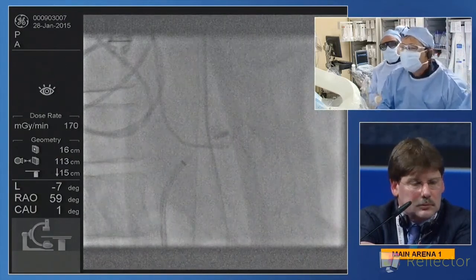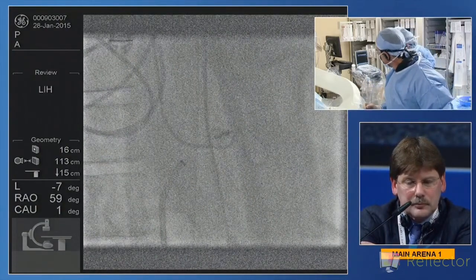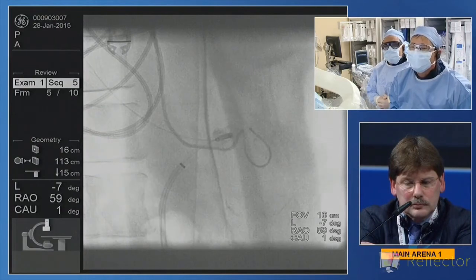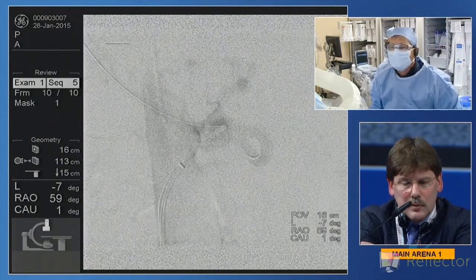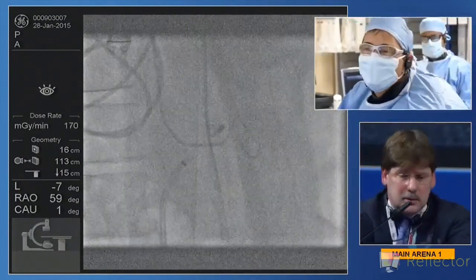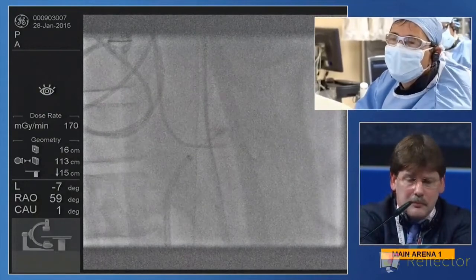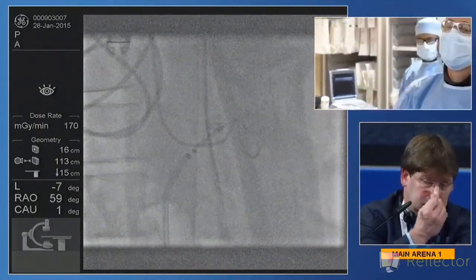I think that actually, looking at that last run, let's see the run back. Replay, please. It's a little hard to see the marker on that. It looks like you need to come back, do we think? Yeah, a little bit, I think. Yeah, right. So there. Now that brings me right to the marker.